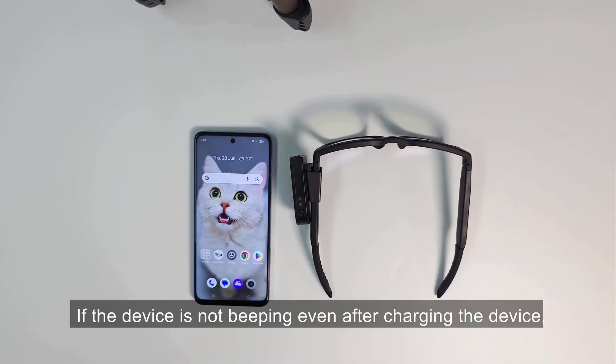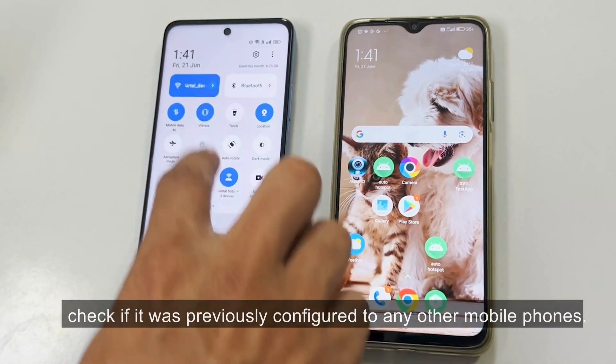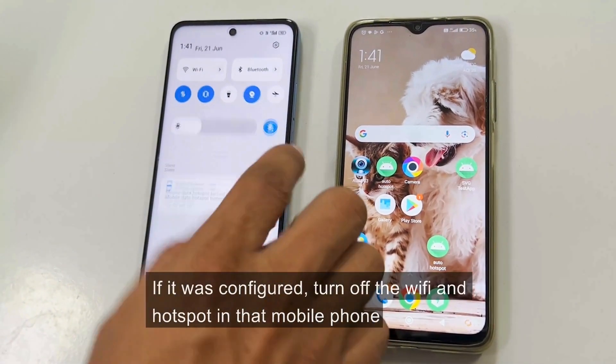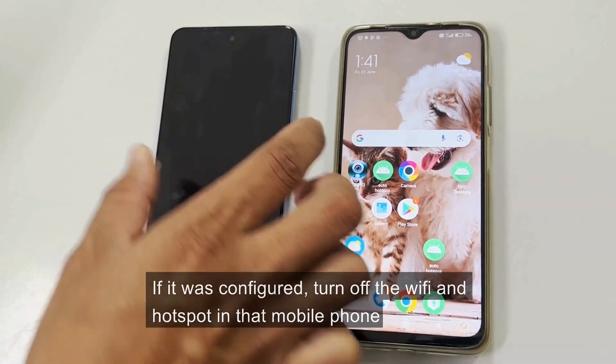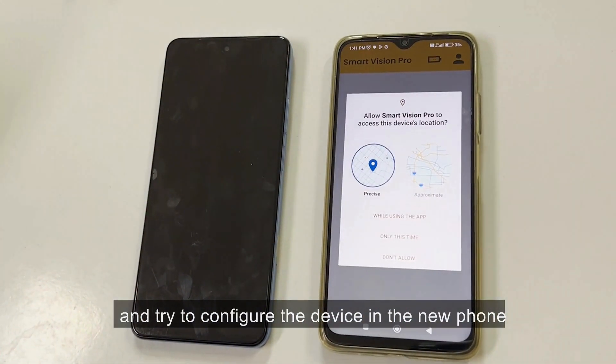If the device is not beeping even after charging the device, check if it was previously configured to any other mobile phones. If it was configured, turn off the Wi-Fi and hotspot in that mobile phone and try to configure the device in the new phone.